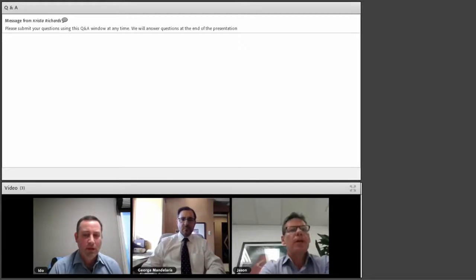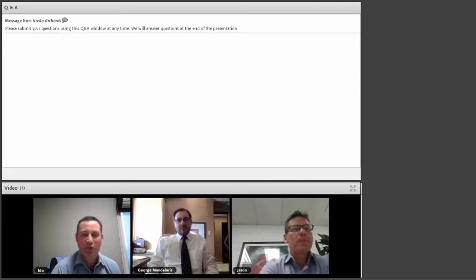Okay. Ido? Yeah. So just regarding the question about the Evalunav, Arish just confirmed to me that it's only in older versions. In the newer version, there is no issue with importing a pre-op scan with the plan without a fiducial.